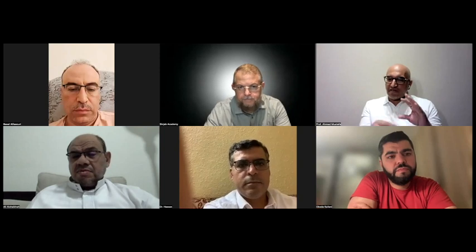It's perfect. And also there is no valve mechanism, so it's thinner. The surface area might be larger than the Ahmed glaucoma valve, but it has no valve. It's just easier to manipulate. Thank you, Obaida. Thank you for the contribution.